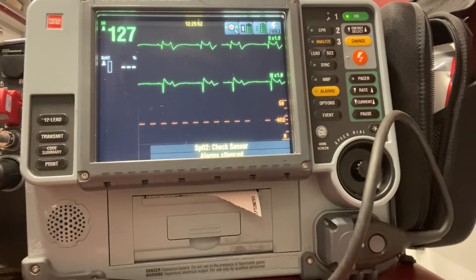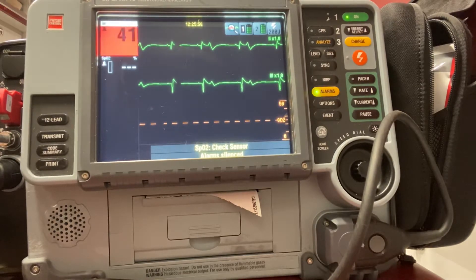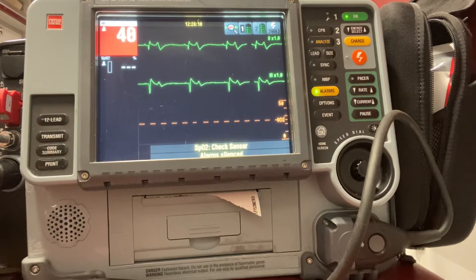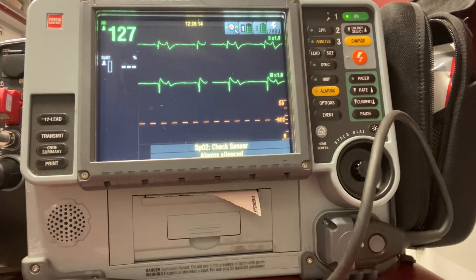This first video is going to cover transcutaneous pacing. With transcutaneous pacing, we're taking an electrical current, putting it through our defib pads, our quick combo pads, and beating that heart for our patient. It requires a lot less energy, so we're going to use milliamps instead of joules. For our defib pads, it's best if we place the pads on the front of the chest and the back of the chest so we get a better current going through the heart.